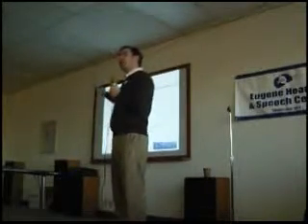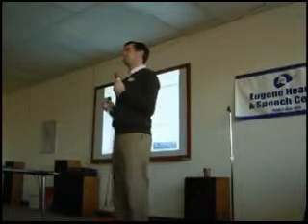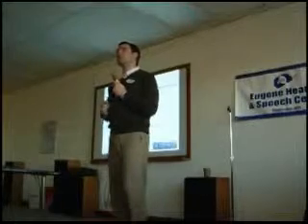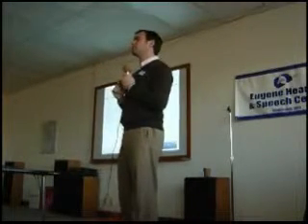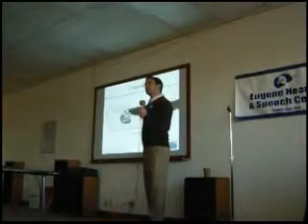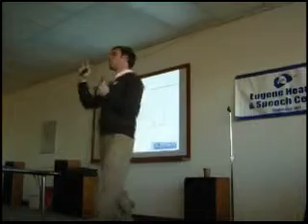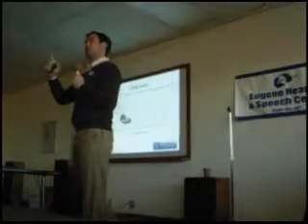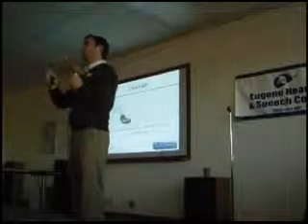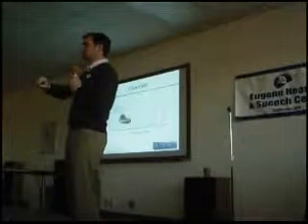So in this demonstration, you've got 2 sounds that are in your environment. With the hearing aid that has 4 channels, both of these sounds happen to be in the same channel. So you have one set of directions. Basically, every channel has a set of directions. If the sounds come in, what should it do with that sound? How much should it turn it up? How much should it turn it down?